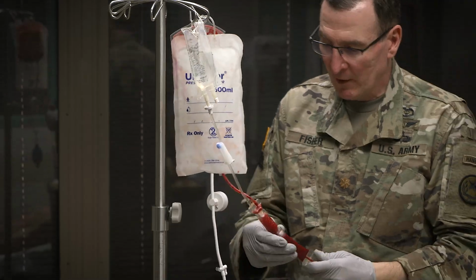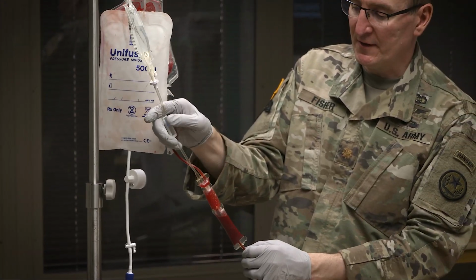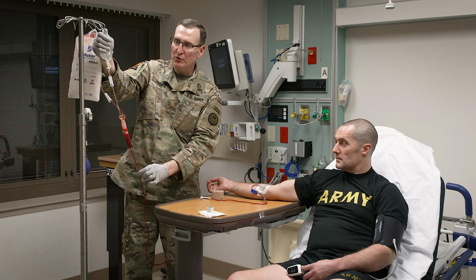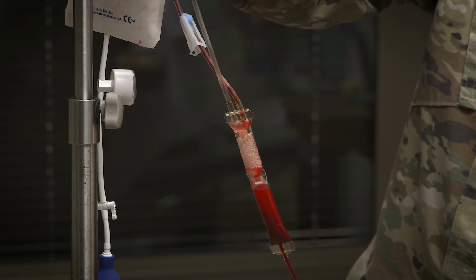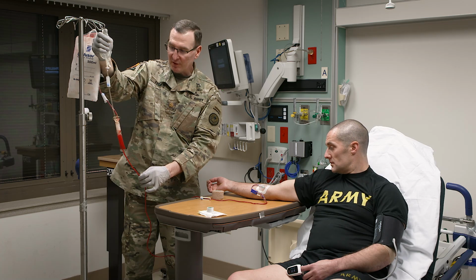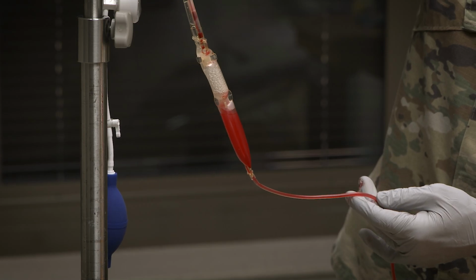So now what do I do? I just do the opposite. I'm going to take this roller, I'm going to roll it up to stop the blood transfusion. I'm going to turn on the saline. I'm going to make sure that's flushing, and I'm going to flush all this through as much as I can without giving too much of the saline. And we know that crystalloid resuscitation can be harmful to our patients, but giving a small amount is not harmful and just helps clear the line in case you need to transfuse more blood, or just to make sure that your patient gets as much blood as they can.